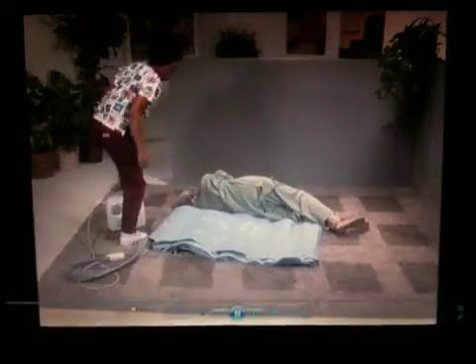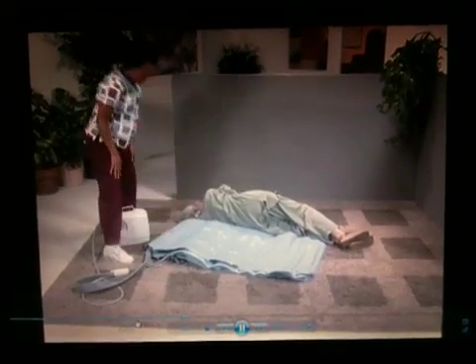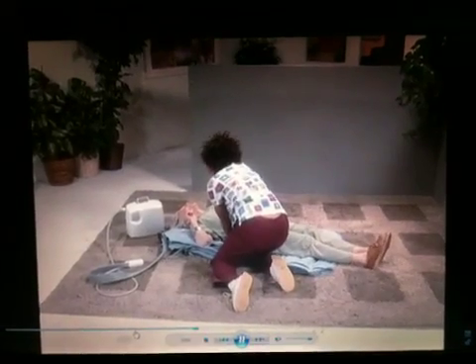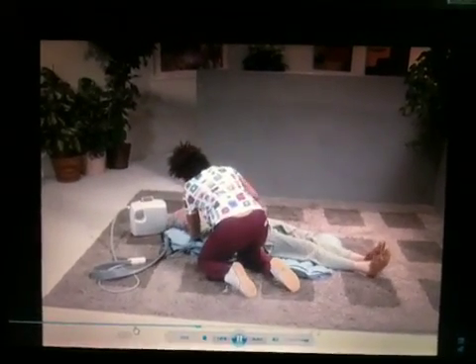After the person has been positioned safely on their side, the caregiver places the lifting cushion next to the person, making sure the Camel logo is aligned with the back of their head. The caregiver assists the person onto the center line of the lifting cushion, making sure the back of their head is on the logo and their hips and legs are properly aligned.